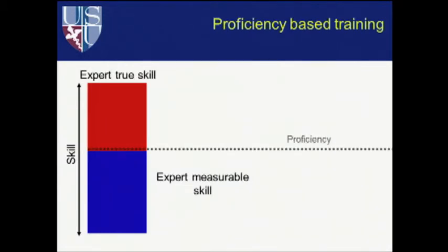If you set that quantifiable amount as your target for your trainees, what that allows you to do is basically get as much bang for your buck as you can out of whatever simulation platform you're using. So your learners can basically train until their measured skill level is the same as the skill level measured on those experts.